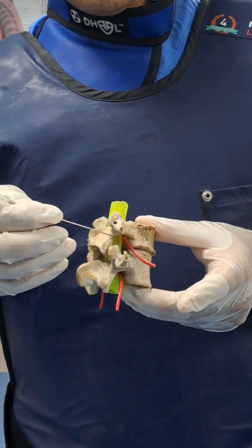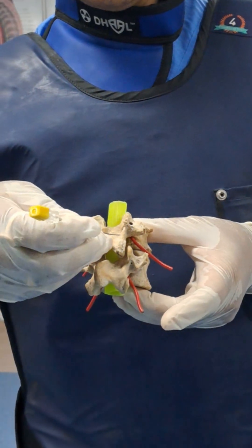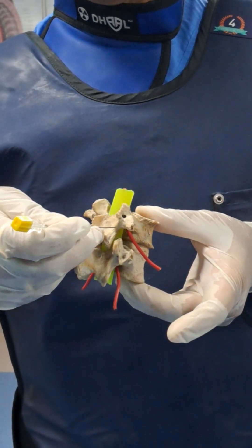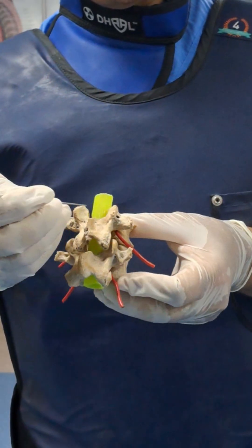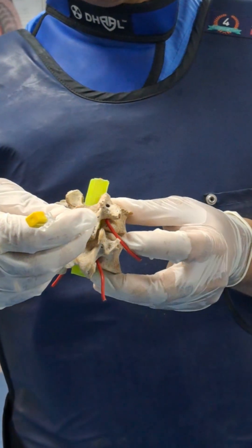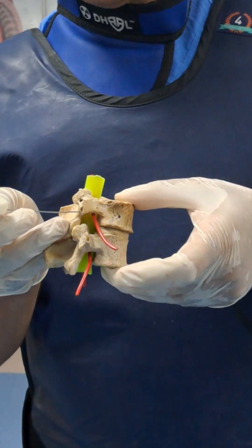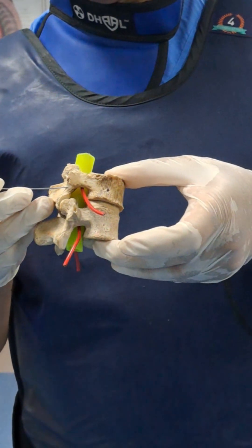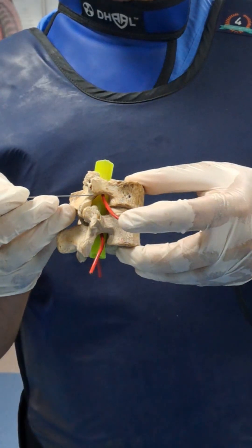In AP or oblique view you cannot see depth on X-ray, so safely first touch the last bony point, which is the pars. First take AP view, then a little oblique so you can go inside the foramen. In this oblique position you are touching the pars. If you don't touch the pars and try to go inside the foramen directly, you will puncture the dorsal ganglion or root. So touch the pars, then come to lateral view, and turn the needle — bending medially touching the pars.